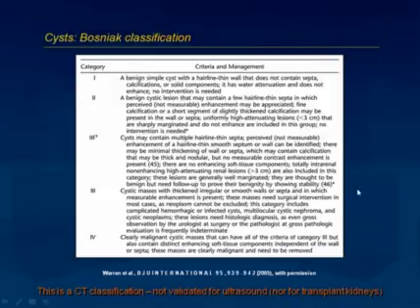Many people therefore prefer to speak of simple cysts, clearly suspicious cysts, or mildly or moderately atypical renal cysts instead of using the Bosniak classification. If used in ultrasound reporting, one should probably say something like, this is a simple cyst 12 mm equivalent to Bosniak class 1, to emphasize the fact that the Bosniak classification is not directly applicable in ultrasound.